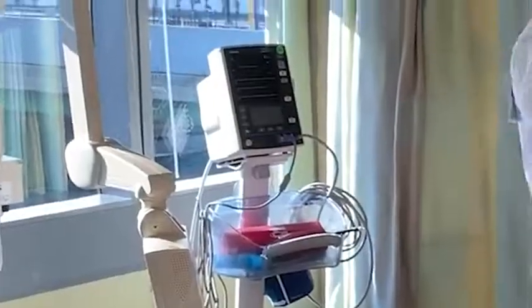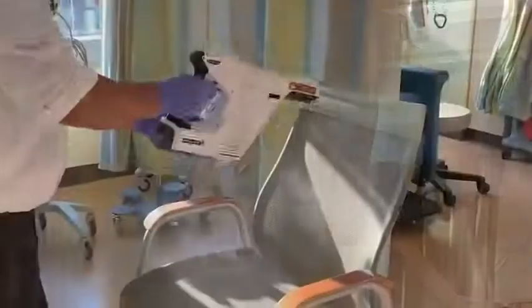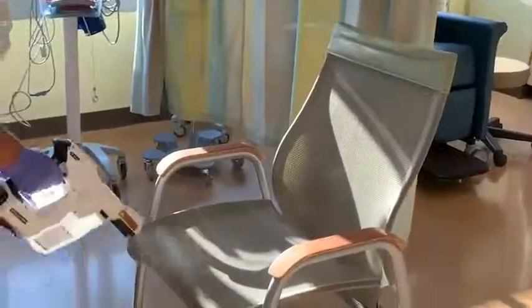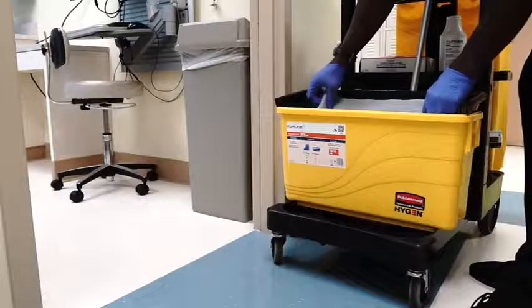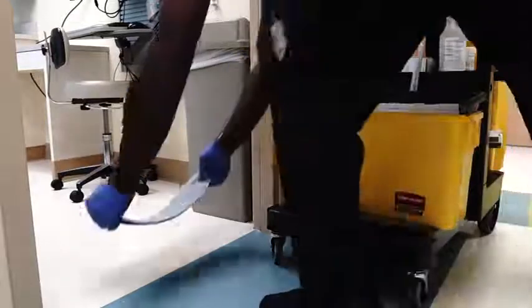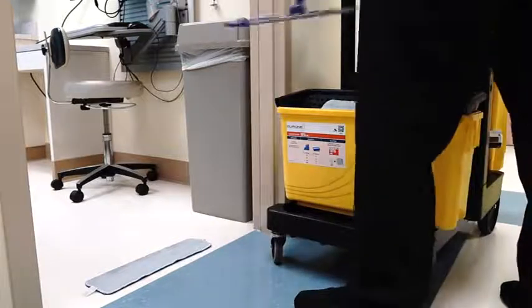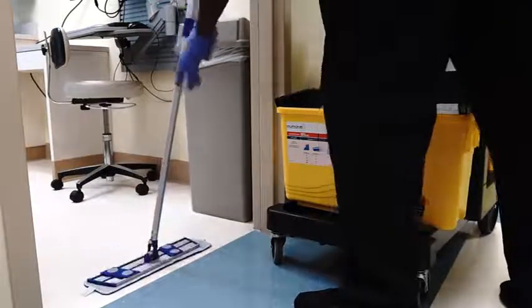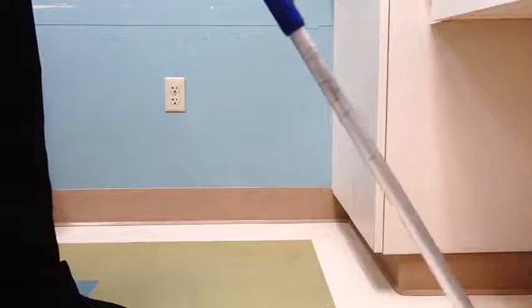Be sure to move slowly across all horizontal and vertical surfaces, including curtains, until all room surfaces are disinfected. Be careful to not oversaturate electronics. Grab a flat mop from the charge bucket. Place the flat mop on the floor and secure the mop on top. Begin mopping the floors from inside the corner of the room, making your way to the door.